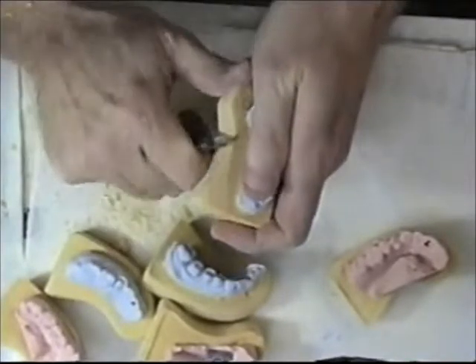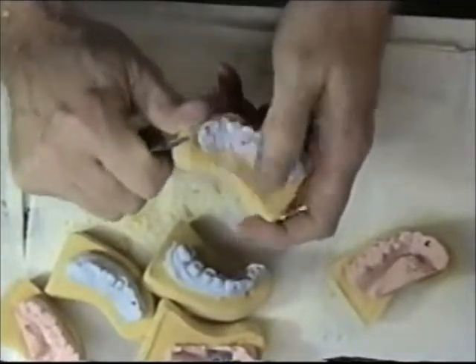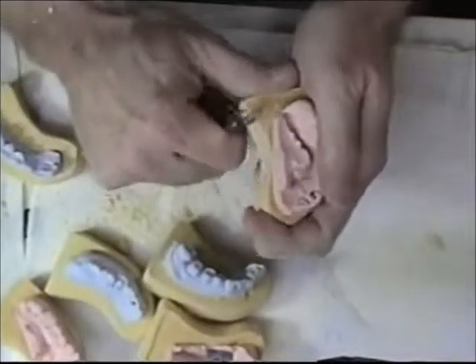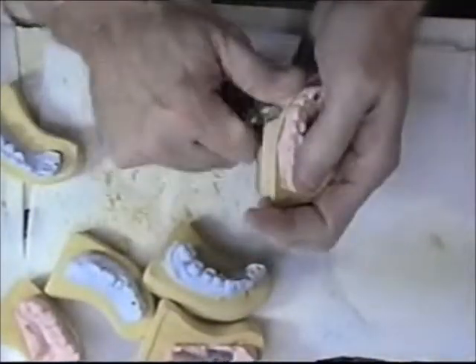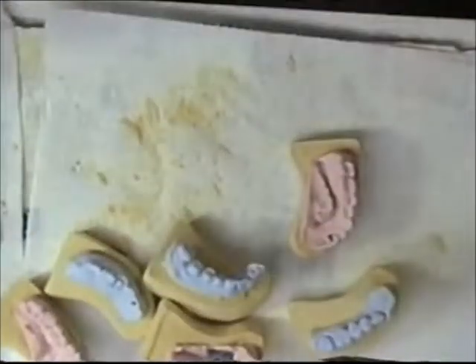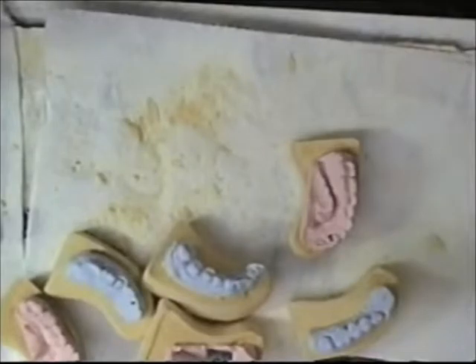Now I'm getting ready to start sawing the sections of the model out. I'm going to clean this up a little bit here, and then I'm going to grab my saw and demonstrate how we saw these sections out.